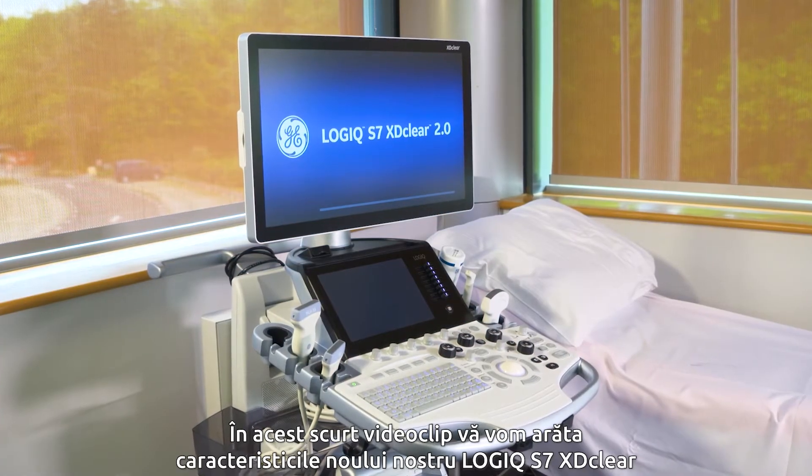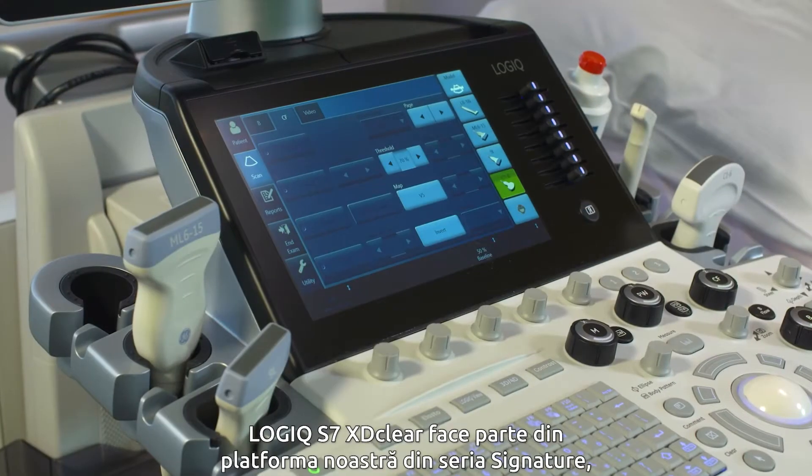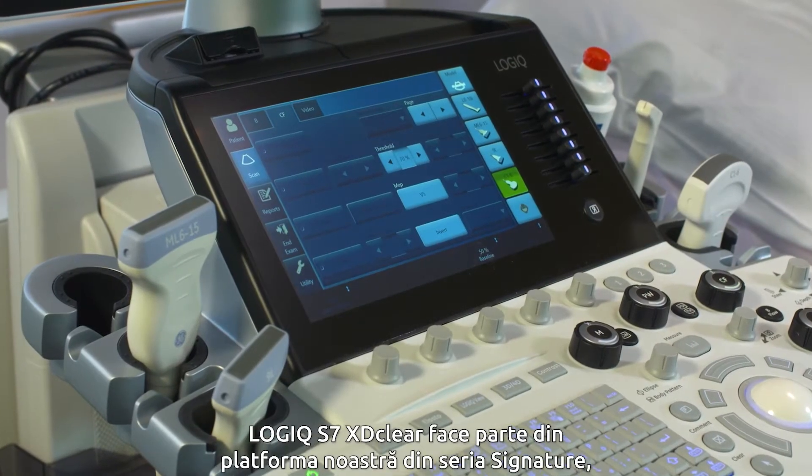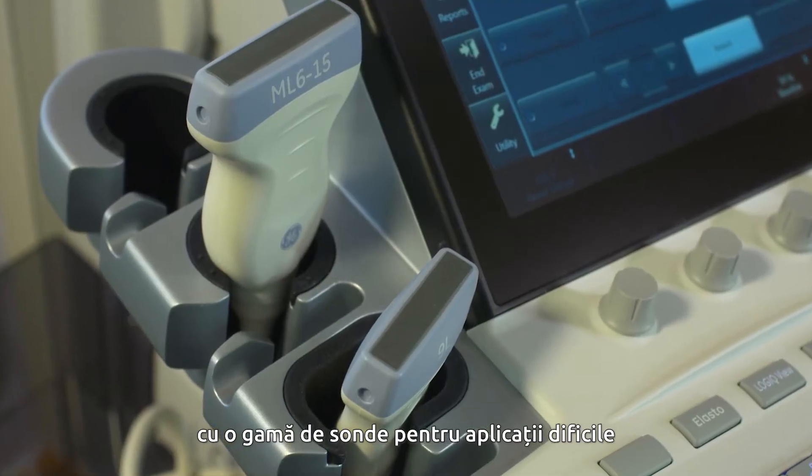In this short video we'll show you the features of our new LOGIQ S7 XDclear. The LOGIQ S7 XDclear is part of our signature series platform with a range of probes for different clinical applications.